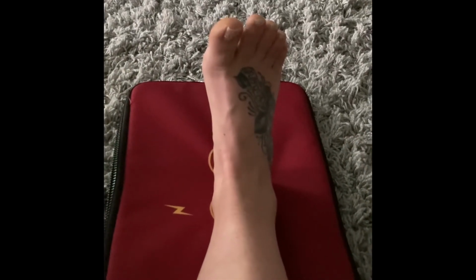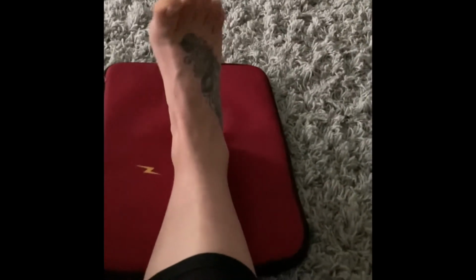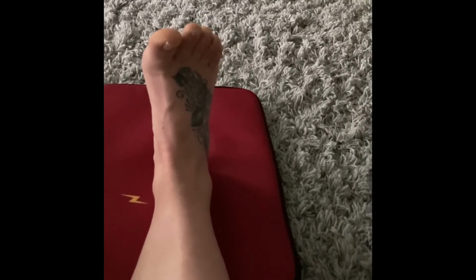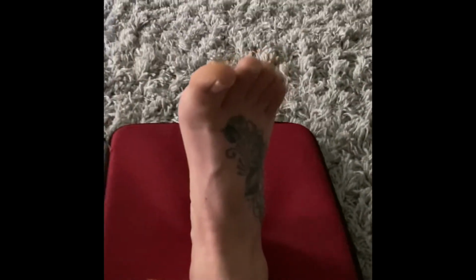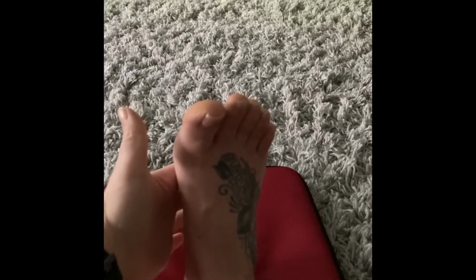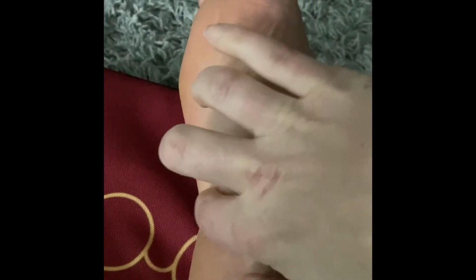Okay, for the semiaxial calcaneus view, patient is going to extend the leg and dorsiflex the foot so the plantar surface is perpendicular to the film. Where they're going to be placed at the edge of the film space, down at the level of the heel. So the image receptor would actually be over there, and the central ray would be coming through the base of the third. It would actually be coming 40 degrees cephalic to enter the base of the third metatarsal. So if you look at my foot, it would be down here, coming through the center of the film space.